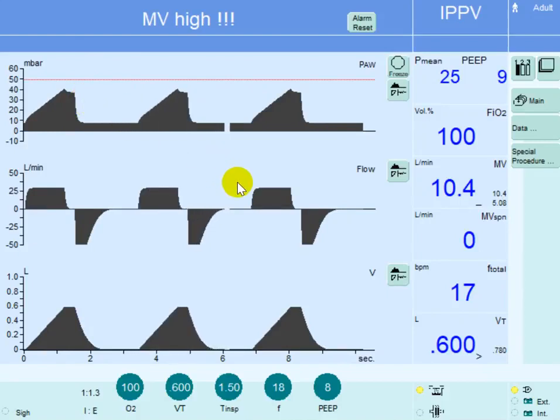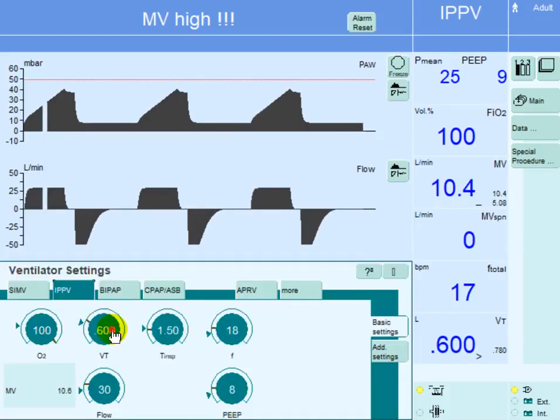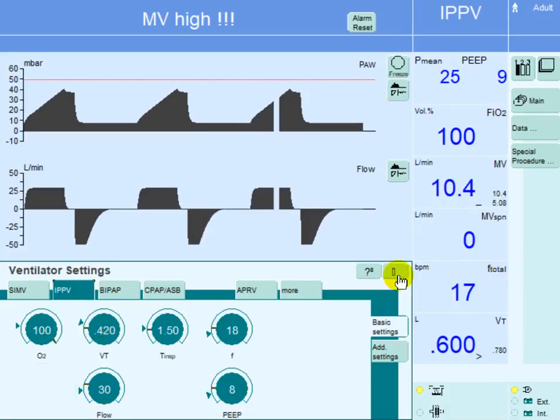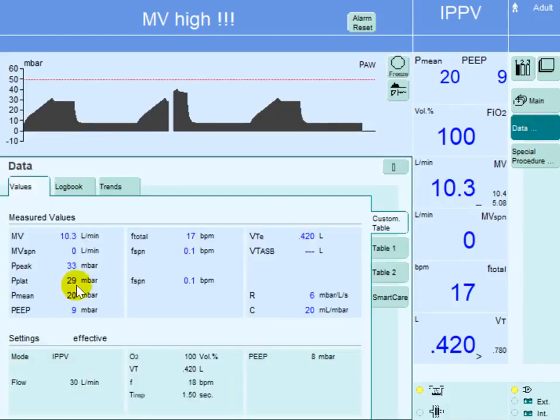To correct these issues, we start by applying appropriate tidal volume per the protective lung strategy for ARDS. For a patient with ideal body weight of 70 kg, starting at 6 ml per kg gives a tidal volume of 420 ml. After reducing the tidal volume, the plateau pressure drops and is now well below the previous level — it is now at 29.